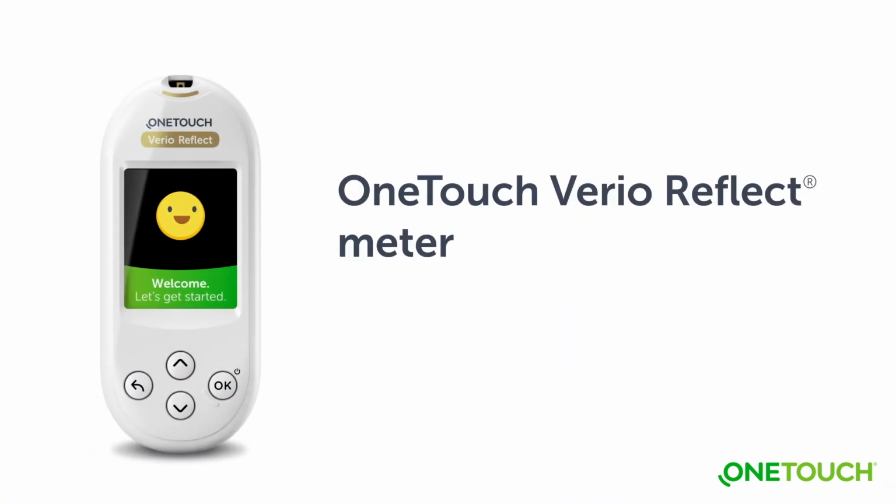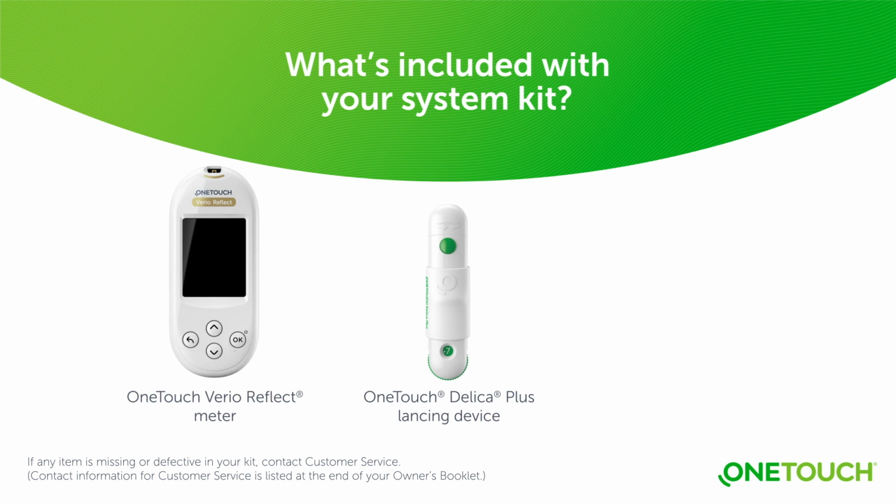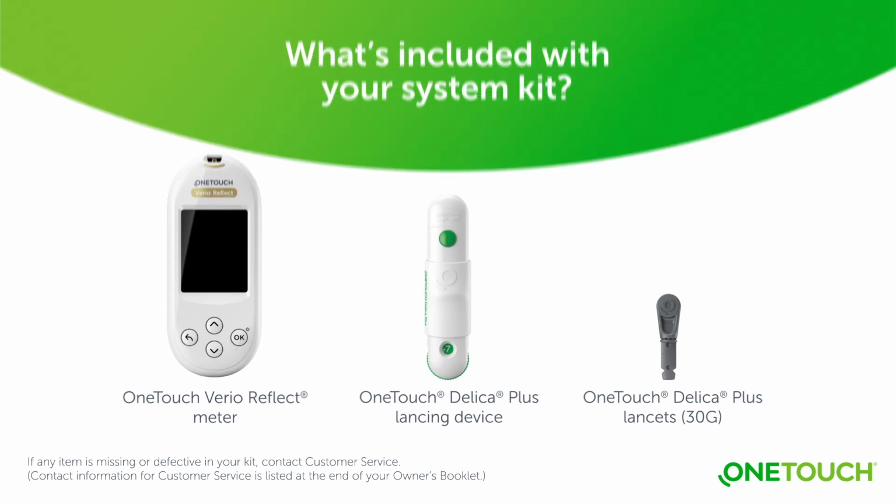Setting up your OneTouch Verio Reflect meter. In your OneTouch Verio Reflect kit, there is the meter itself, the OneTouch Delica Plus lancing device, and a pack of OneTouch Delica Plus lancets. The OneTouch Verio Reflect meter uses OneTouch Verio test strips and control solutions, which are available separately. If any item is missing or defective, contact customer service.